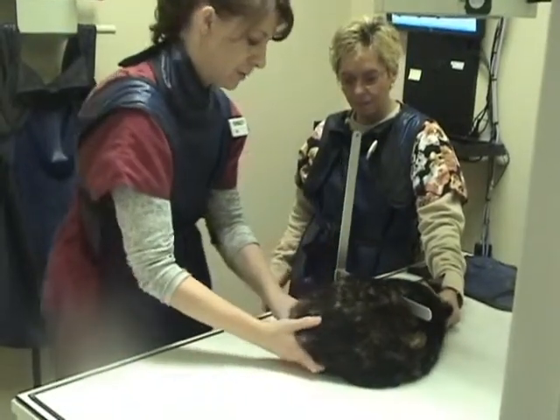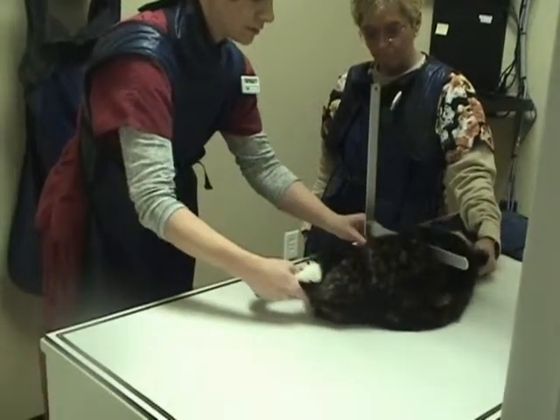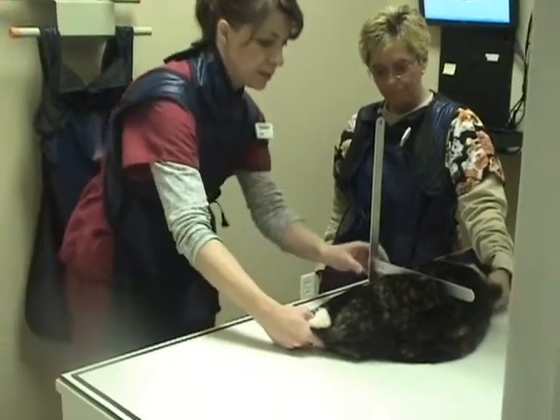At my clinic, we do an initial set of survey radiographs, a set after administration of barium, and a set again at 15 minutes, 30 minutes, 1 hour, and then again at 2 hours. This set includes both lateral and VD views.